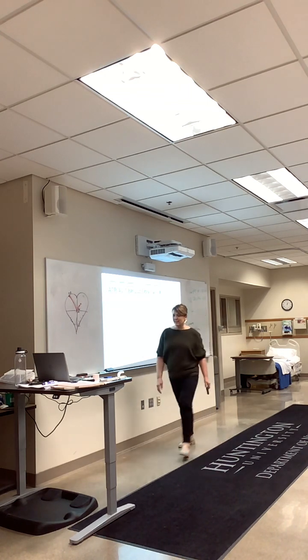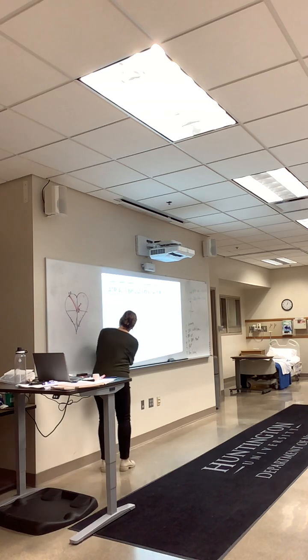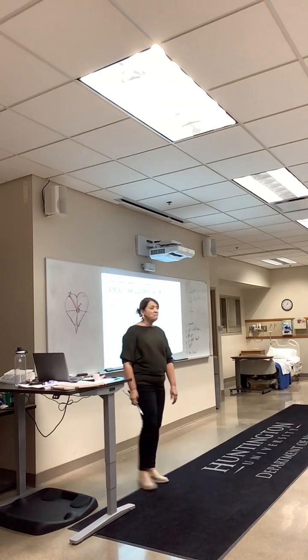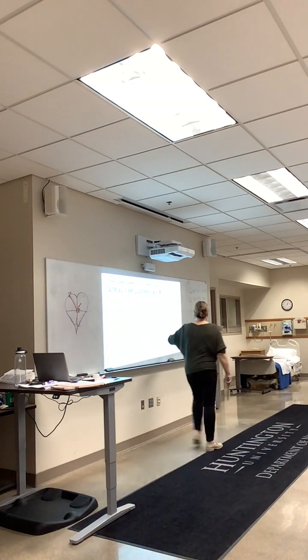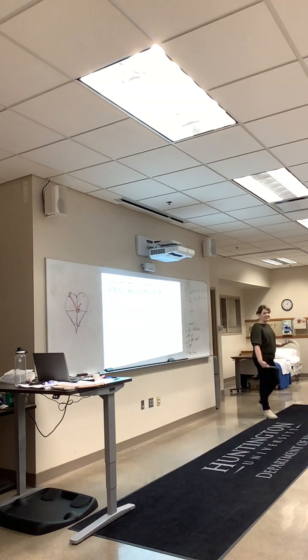Well, let's measure that thing. It looks a little funny, doesn't it? 1.5 or 2 boxes? I can't tell. That's just under 2 boxes. So is that okay? Yeah. Okay, so it's still narrow. What's my PR interval? Can you measure it? No, there's just too many P waves. It's nothing measurable. So there's P waves present, but I can't measure that, so this one we don't even worry about here.